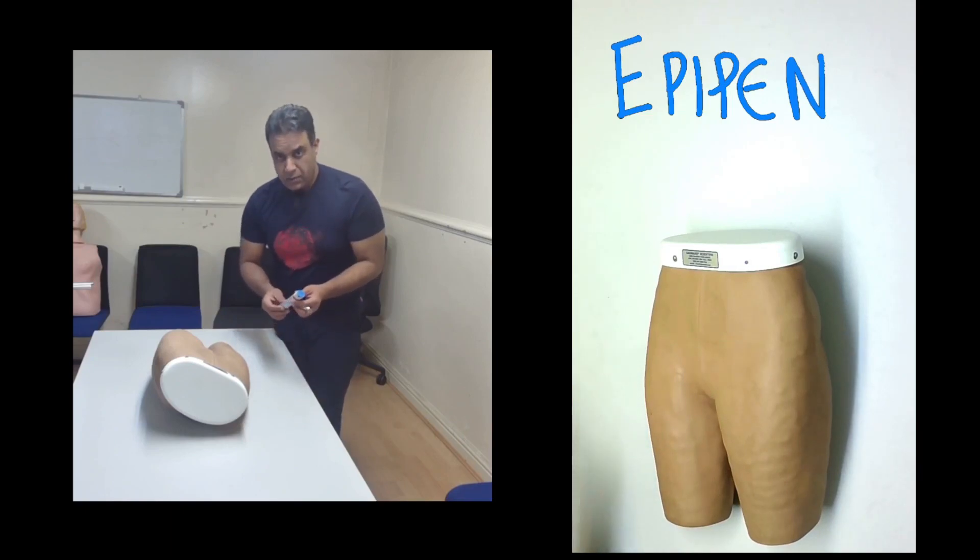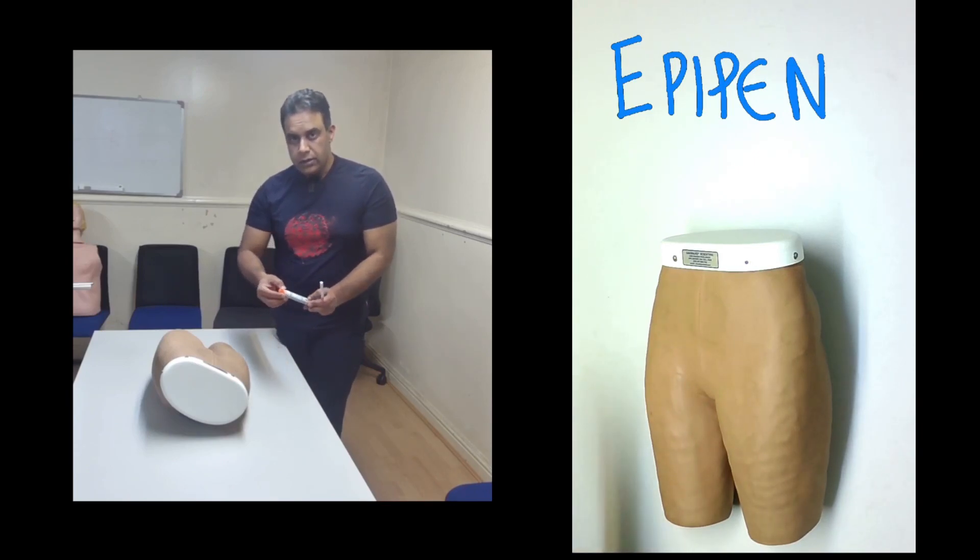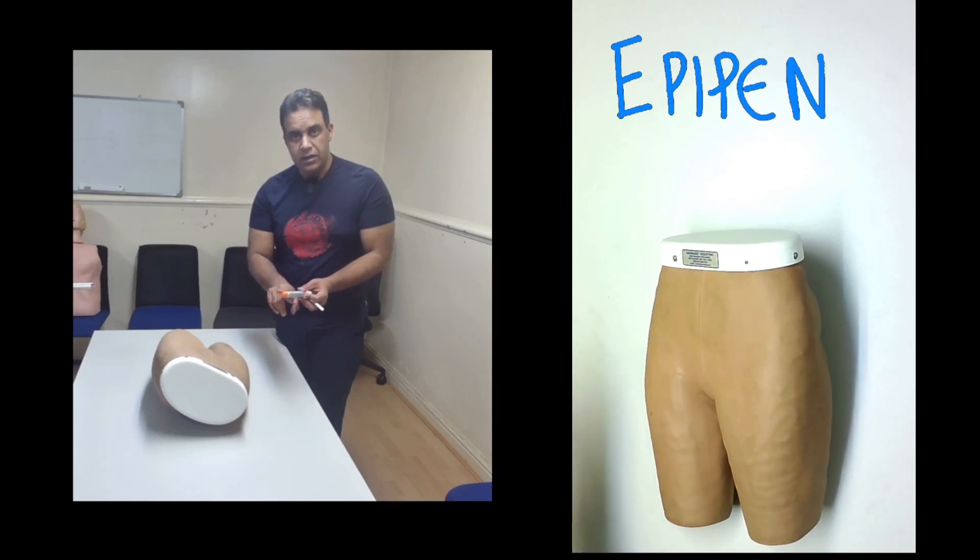There are three parts of the EpiPen. This blue part is the locking key — if it is in place, the device will not work at all. This is a safety cover for the needle, and the needle is hidden inside. The middle part contains the medication, which is adrenaline.